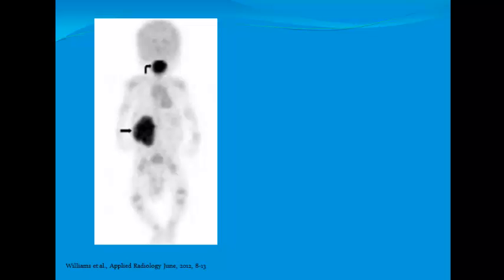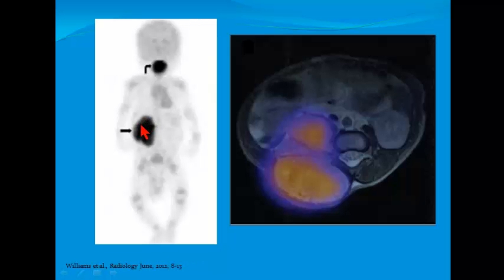Patient, again with rhabdomyosarcoma, there's uptake in the oral region because the patient had a pacifier, so that was just not significant. However, there was uptake in the tumor mass in the right abdomen. And then on MR, we have a good definition of where the uptake is in the tumor on PET. And this would presumably aid, of course, in surgery, if the surgeons had access to these images, and also potentially in radiotherapy planning, if they knew what areas of the tumor were FDG avid.